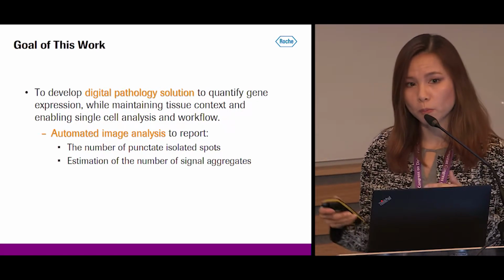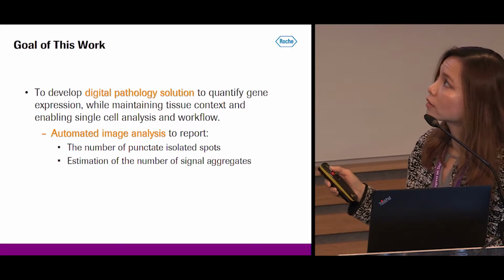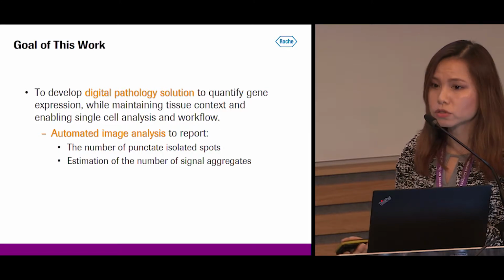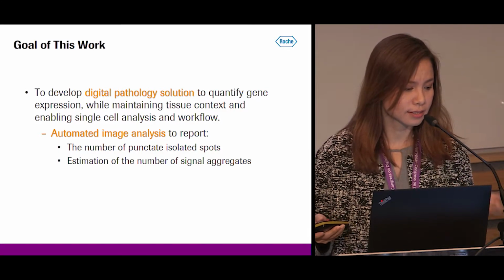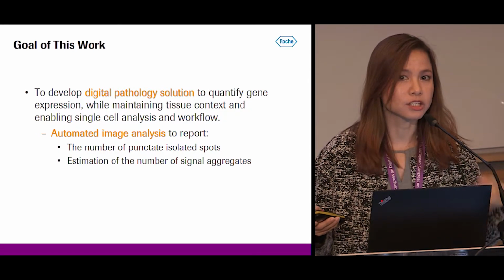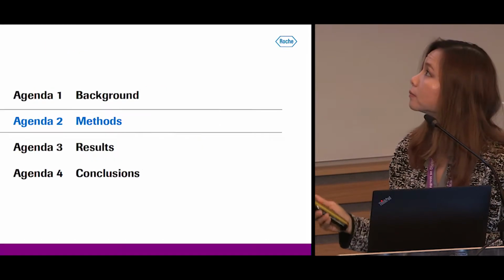Specifically, we proposed an automated image analysis framework that can report the total number of punctate isolated signals and also the estimation of the total number present in the signal aggregates.